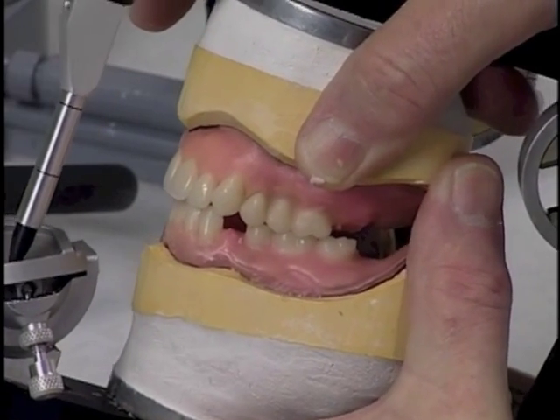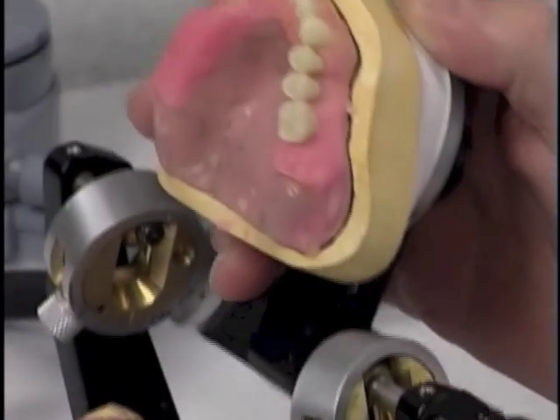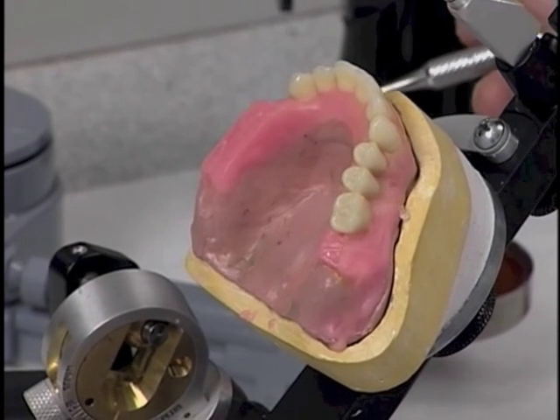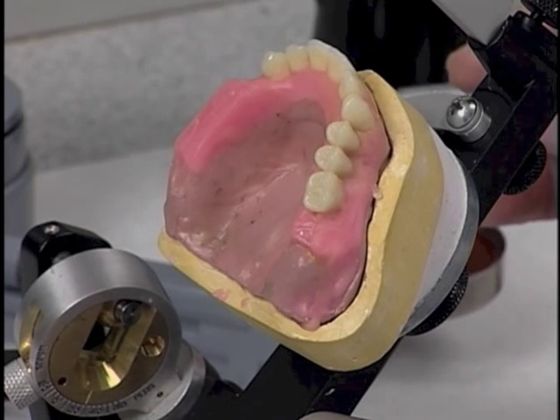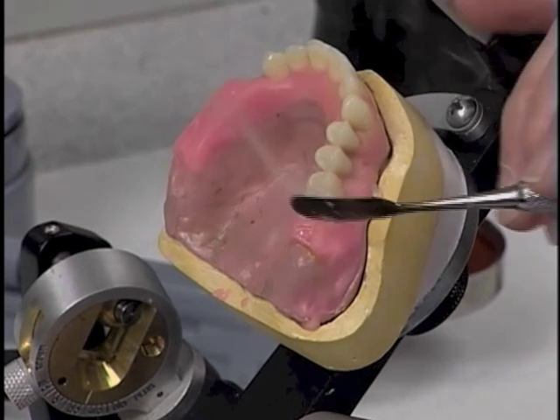Very nice. Now, our next tooth to arrange will be the maxillary second molar, much in the same manner that we arranged the maxillary first molar, trying to maintain good working contacts, good balancing contacts, and good protrusive contacts.